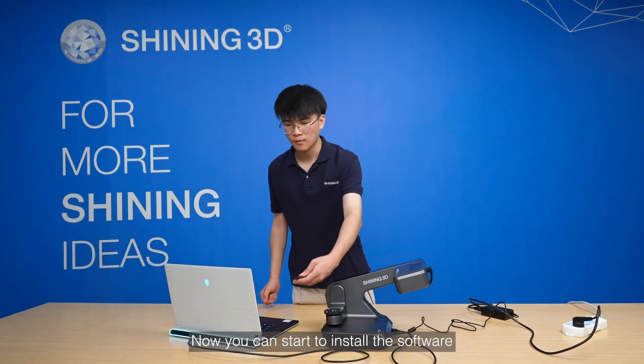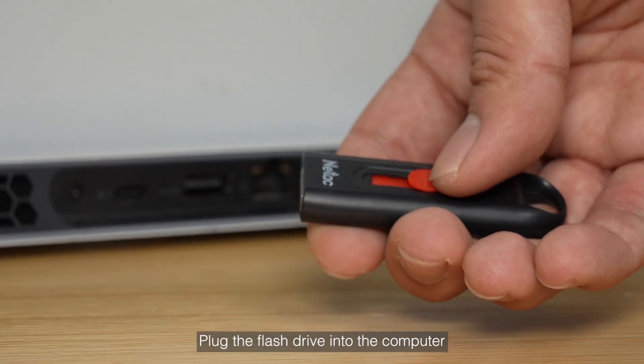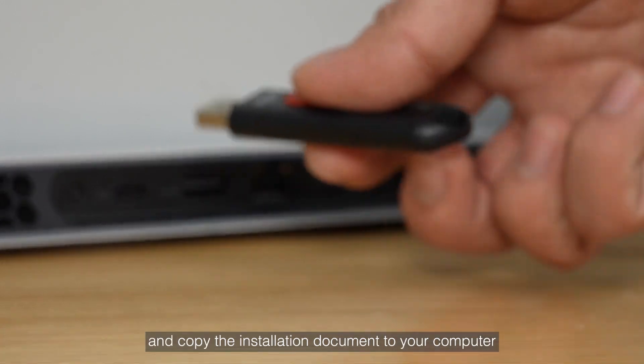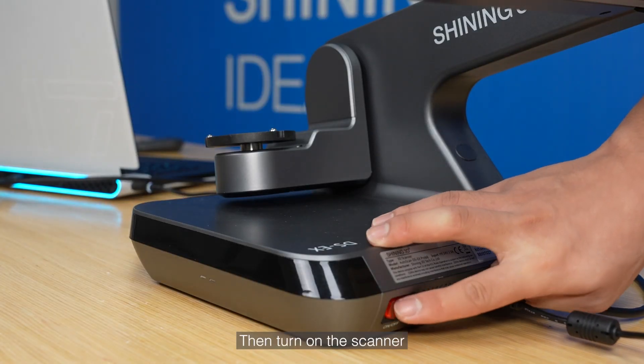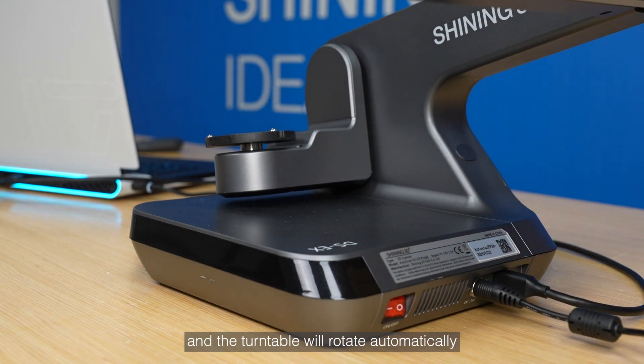Now you can start to install the software. Plug the flash drive into the computer and copy the installation document to your computer. Then turn on the scanner, and the turntable will rotate automatically when the scanner is connected correctly.